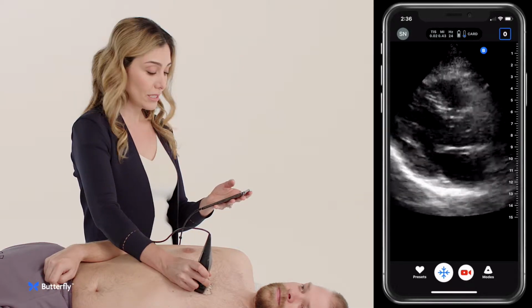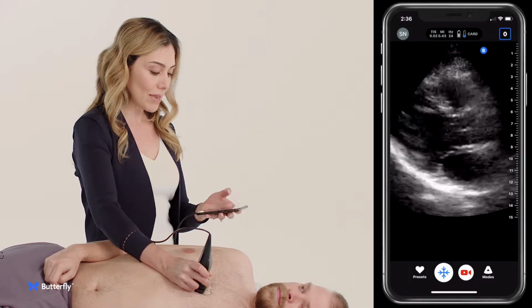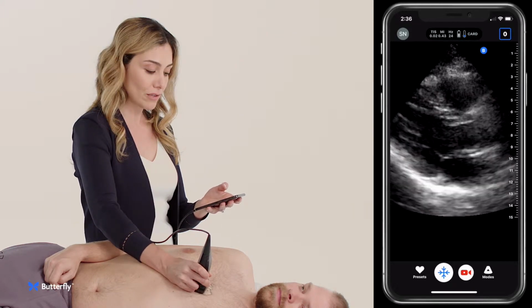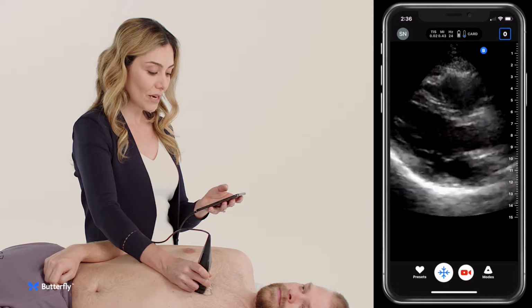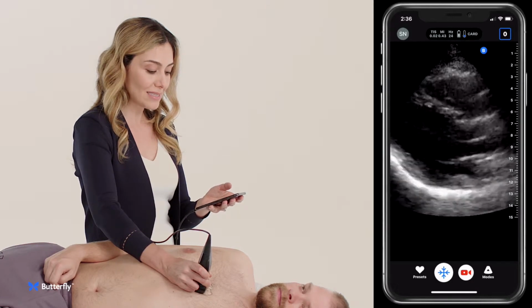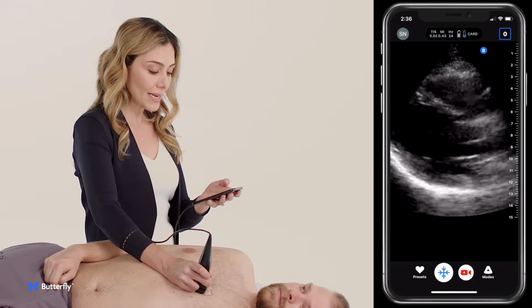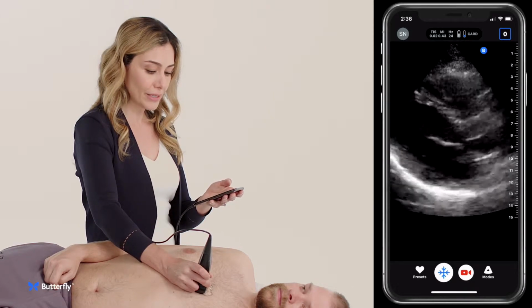of the basilar portions of the left ventricle as well as the mid portions of the left ventricle. You shouldn't and can't see the apex in this view. You can also see the RV at the very top of the image, and what you're looking for is to see if the heart is thickening, if the walls are approximating each other, and the contractility looks good.